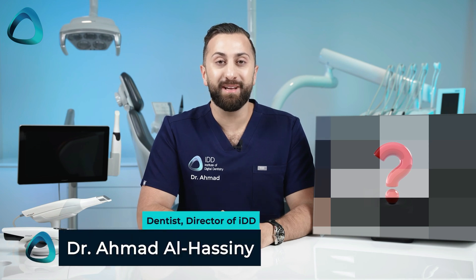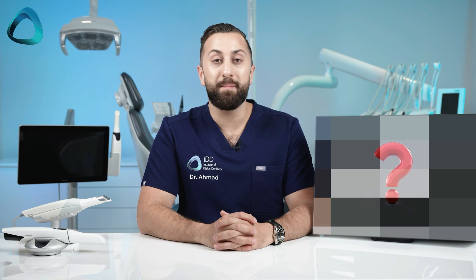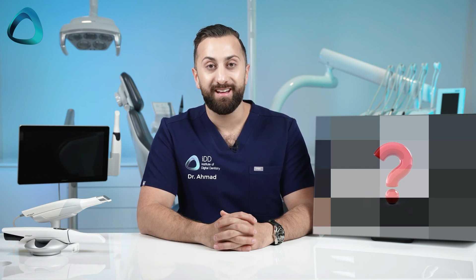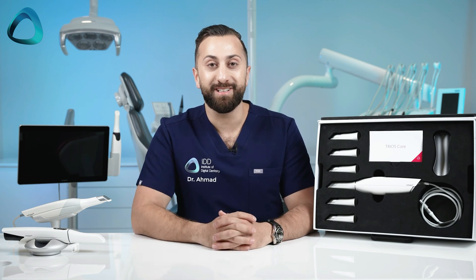Hey guys, Dr. Ahmed El-Hasni here from the Institute of Digital Dentistry. 3Shape just released a brand new scanner, which is their most economical option yet, even more affordable than the Trios 3. This is Trios Core. Let's get into it.